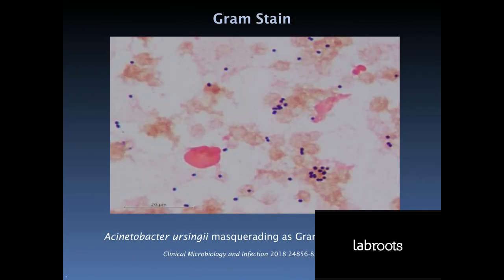Here is another one for the advanced players. Acinetobacter is gram-negative, yet in this positive blood culture, it is appearing as gram-positive cocci. This is a distinctive feature of Acinetobacter that is sometimes seen and can be recognized by trained microbiologists, but not by non-microbiologists. The point in showing these 2 gram stains is to drive home that it is critical to have proper microbiologists to do follow-up tests and interpretations.